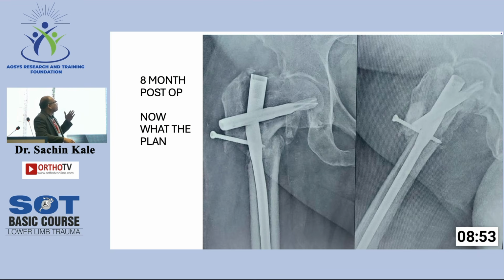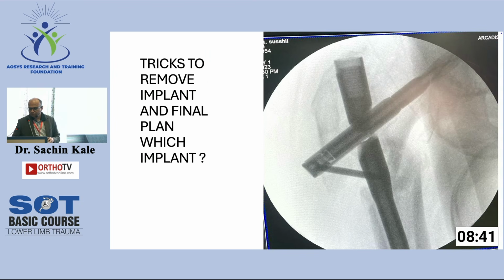So most important, what I want to say is don't remove the distal screw first. First do the proper opening up completely, and only once you get hold of the distal fragment of the nail, because that may go and sink in. So that's the thing. Okay, very good. So this was the discussion.